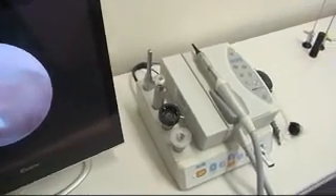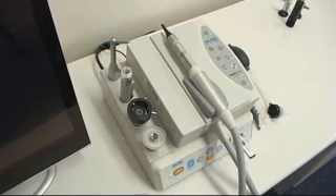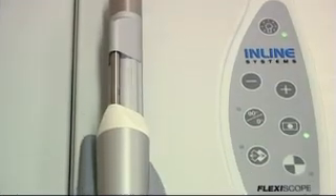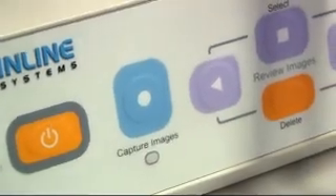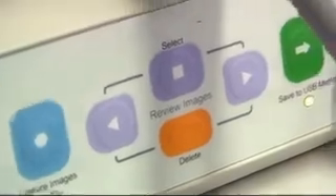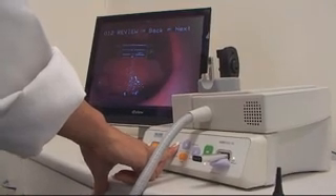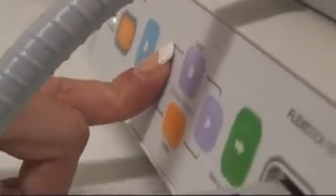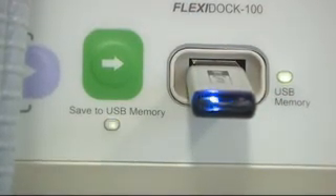Operation of the FlexiDoc 100 is designed to be intuitive and easy, with all controls and prompts appearing on the screen. The camera is simply switched on and the desired probe selected. Once the probe has been positioned and the picture is on the screen, the footswitch is pressed to capture the image. This can be repeated as many times as required, with all images stored on the internal memory of the unit. Once the sequence of images has been completed, the green transfer button is pressed to move the images to a fresh directory on the USB stick.